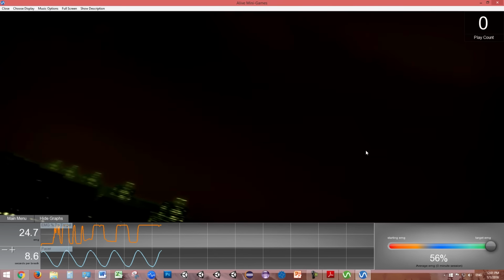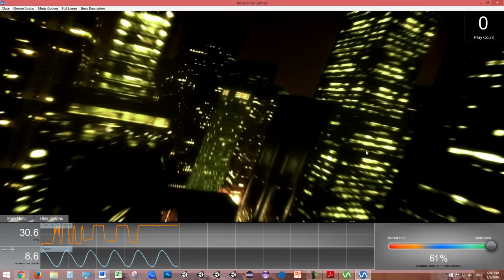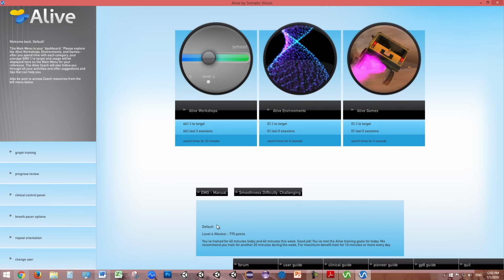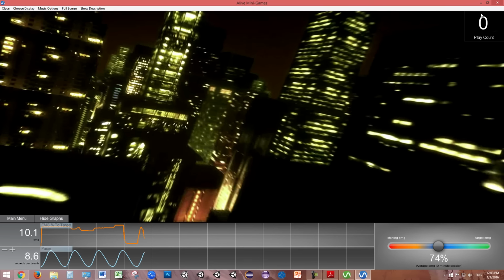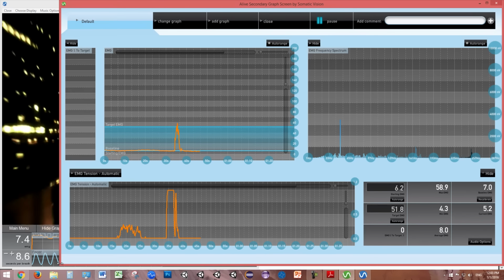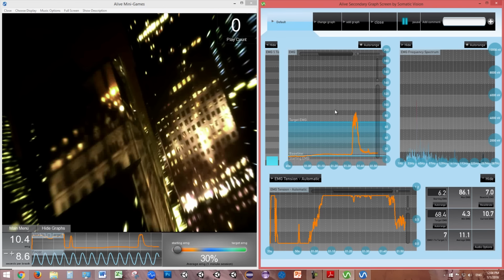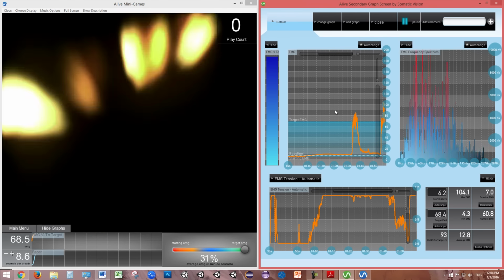If the EMG seems poorly calibrated, you can detach and then reattach one of the sensors to recalibrate the EMG, or go to the main menu, choose EMG Manual, and then manually adjust the starting and target EMG lines. In the secondary graph screen, I can manually set the target EMG and starting EMG values. Then I need to activate my muscles to reach the target EMG state in order to progress forward in Night Flight.